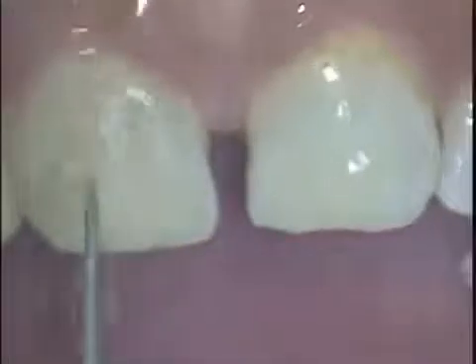In this sixth case, we will demonstrate a midline diastema closure. Here, a small amount of enamel is removed in order to allow a nice blending of the composite onto the tooth structure. In addition, surface staining is also removed using a high-speed burr.